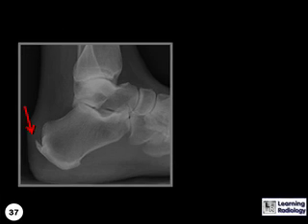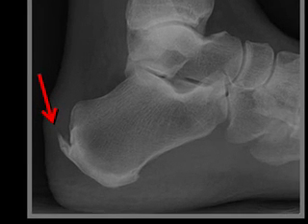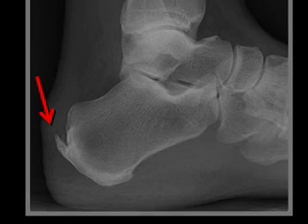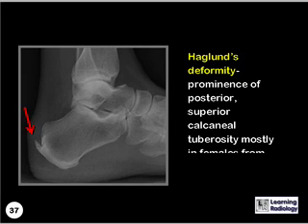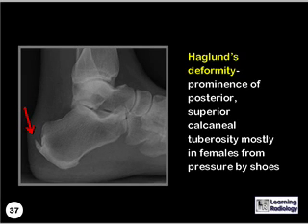What is the name of that deformity? This is Haglund's deformity, which is prominence of the posterior superior calcaneal tuberosity, seen mostly in females, presumably from pressure by shoes.